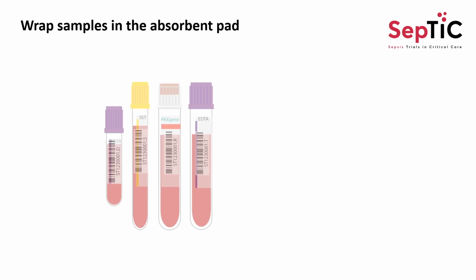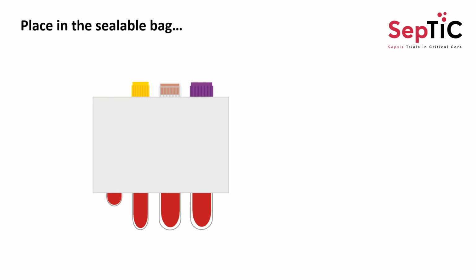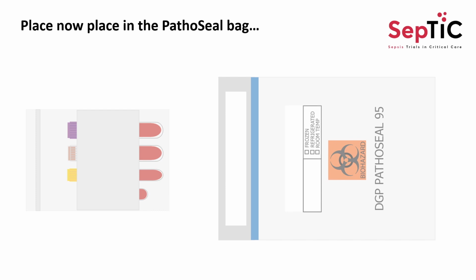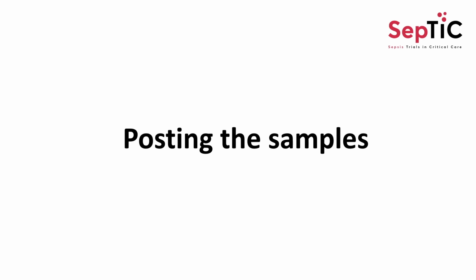In order to get ready to post the samples, they should be wrapped in the white absorbent pad that came in your pack. Once this has been done, they can be placed in the small, clear, sealable bag, which should then be sealed. That bag is then placed into the pathoseal biohazard bag, which should be sealed following the instructions that are printed on the bag itself. Once the samples have been collected and placed in the bags, they're ready to post.